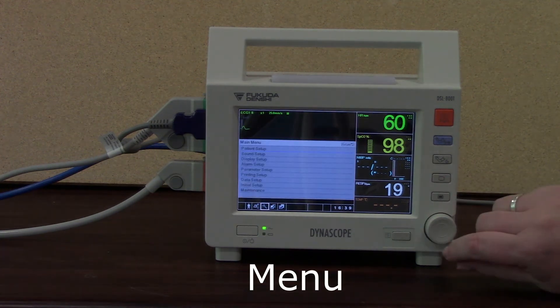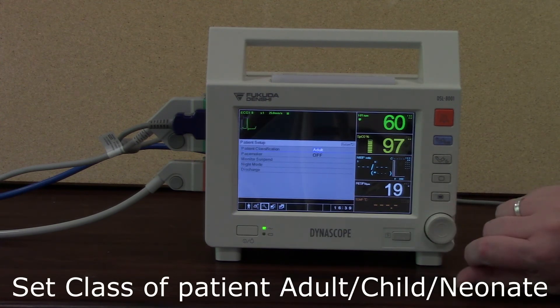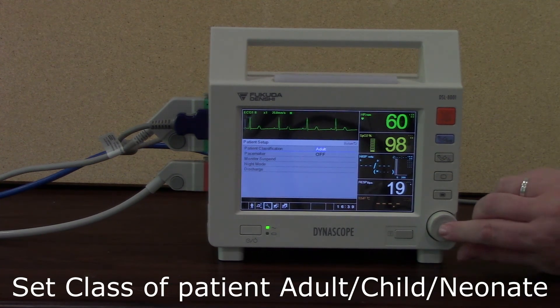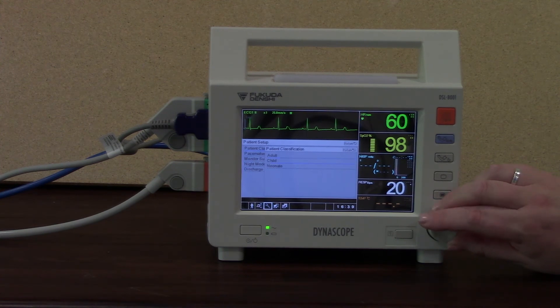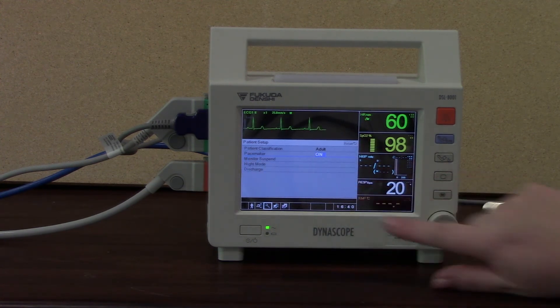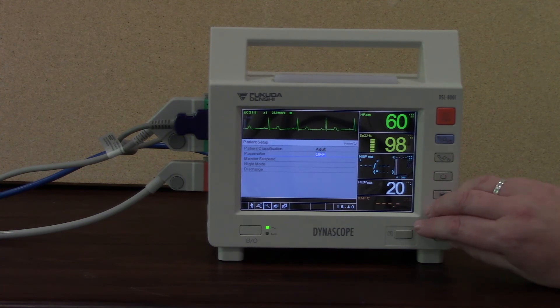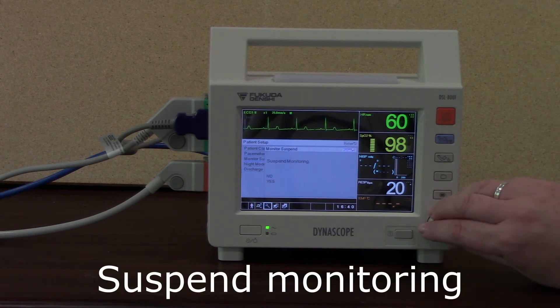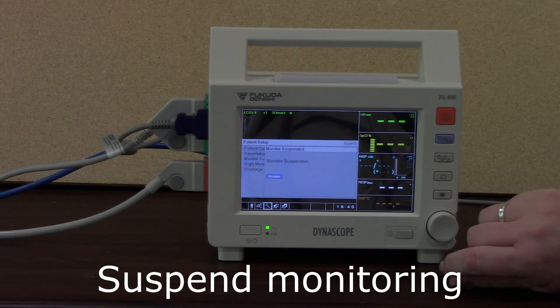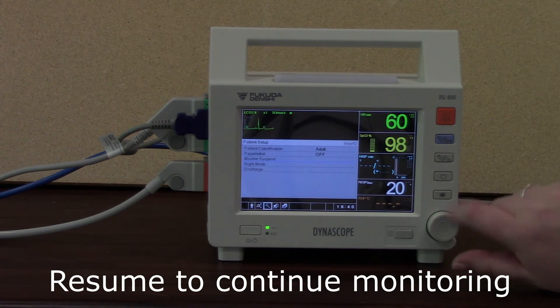Back in the menu area now. If I wanted to set my class of patient, I go to patient setup, then patient classification — selecting adult, child, or neonate. Equally, if I wanted to set my pacemaker to on, I can do that by going to pacemaker and setting it to on or off — it defaults to off. If I want to temporarily suspend monitoring, I select and press yes. Monitoring is now suspended — if I was taking my patient off to x-ray, scan, or letting them get up to use the bathroom, this is when you'd suspend monitoring. Then press resume and I'm straight back into monitoring.